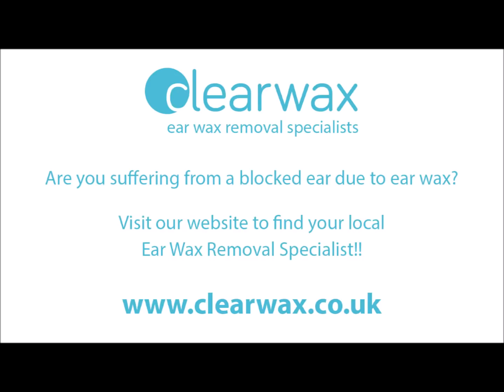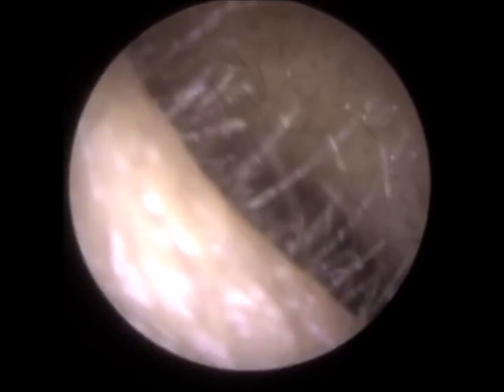So client 1, which you will see in a moment, attended with a fully occluding right ear canal. The earwax extended right from the entrance of the ear, as you can see here, right towards the eardrum. So it's quite a severe impaction. They were barely able to hear the suction machine today.